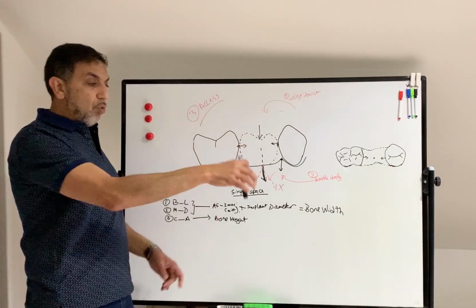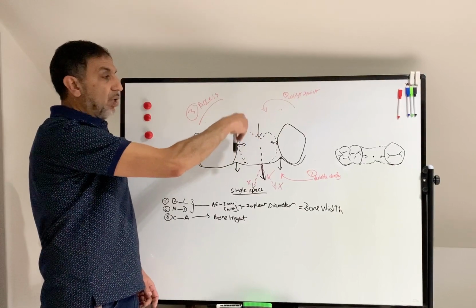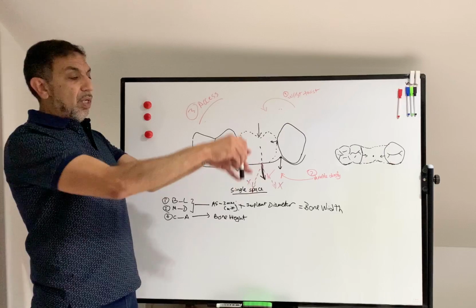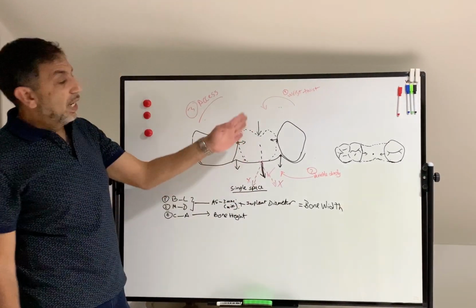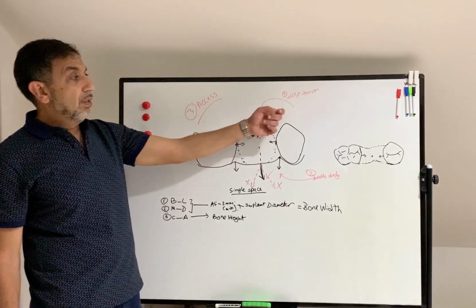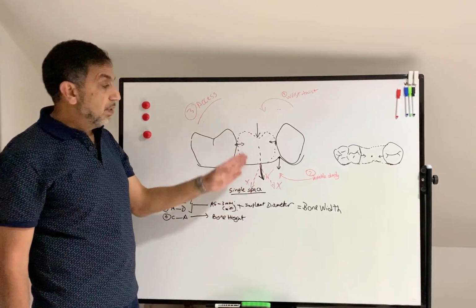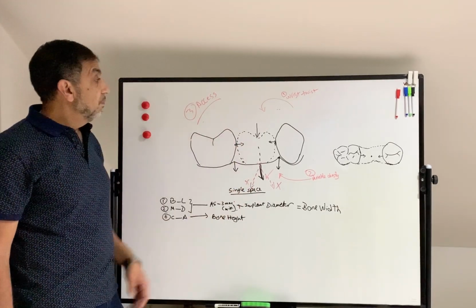So don't put your hand or your finger rest on one of the teeth while you're trying to drill, because then your wrist will twist. So up and down in a straight line. That's the first problem that causes the trajectory of the implant placement to veer off the ideal straight path.